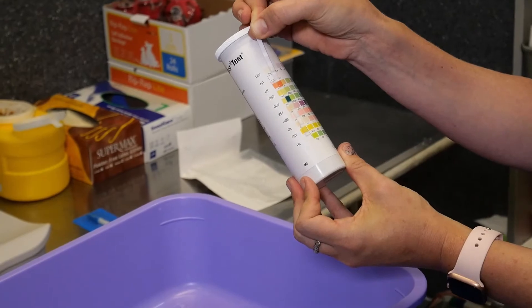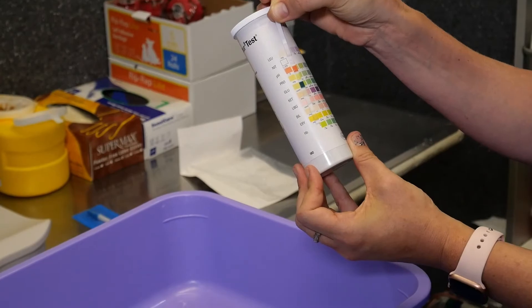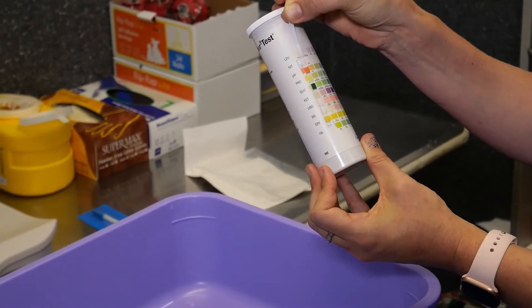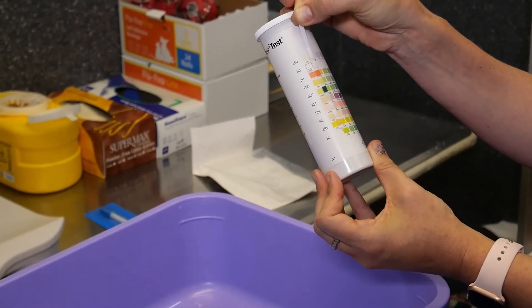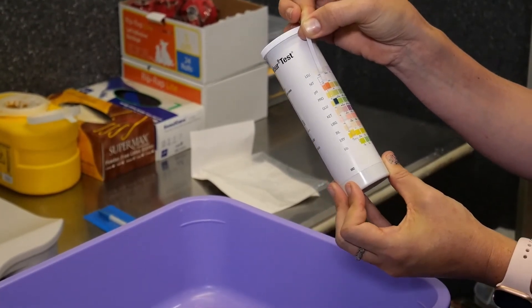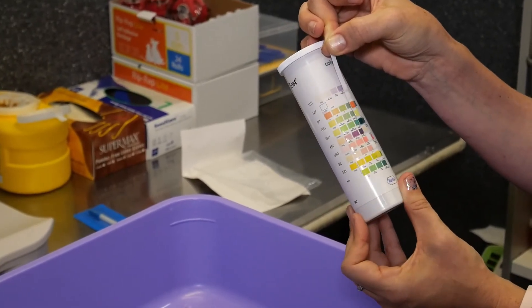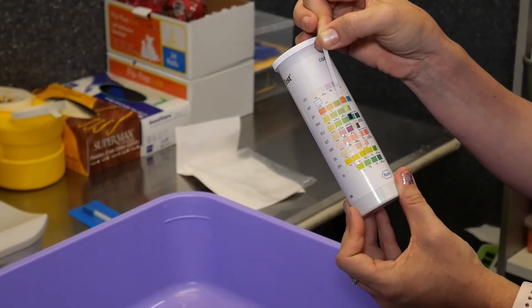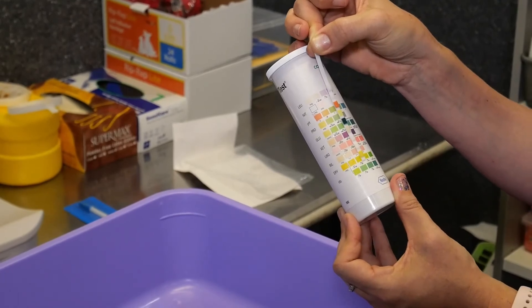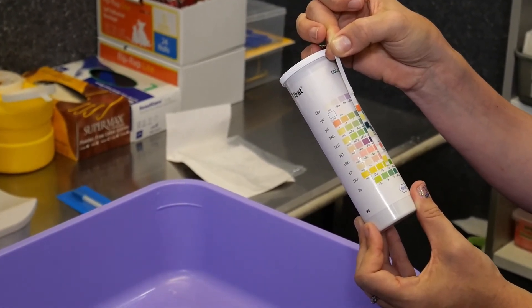Next we look at the ketone strip and as you can see this one is sitting close to this slightly orange box, which would be a negative test result. Now if you have a diabetic patient and you get a positive ketone — in this darker purple tone here — then that would certainly be an indicator that you should seek veterinary advice with your cat.